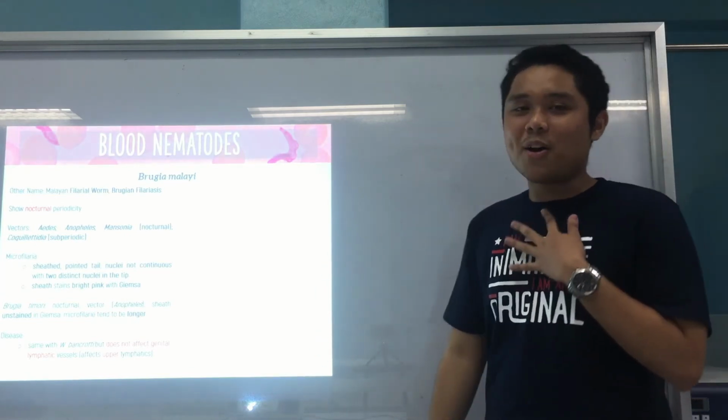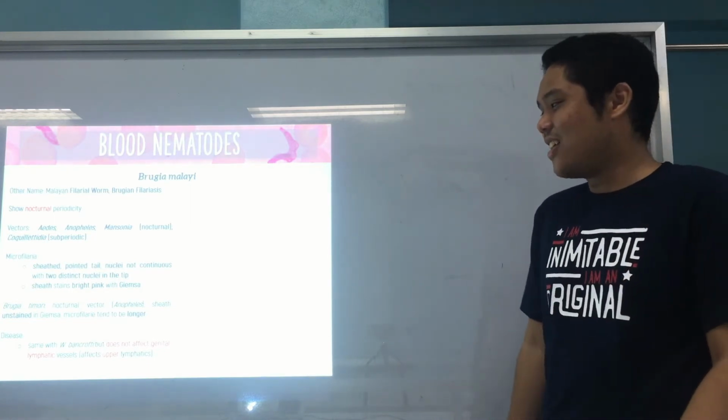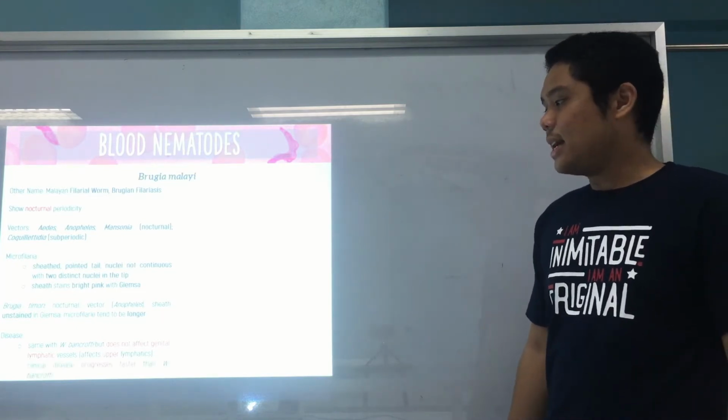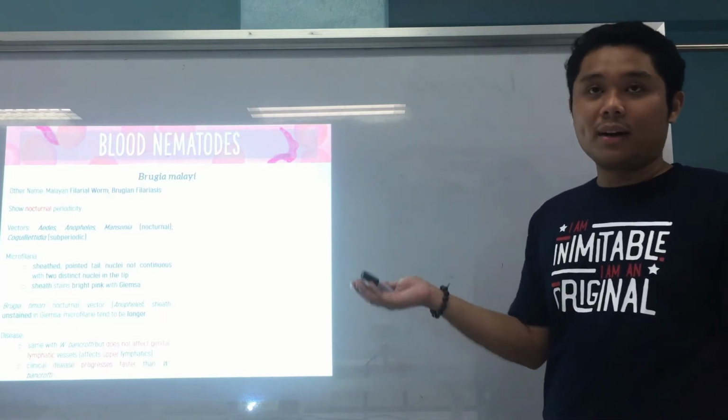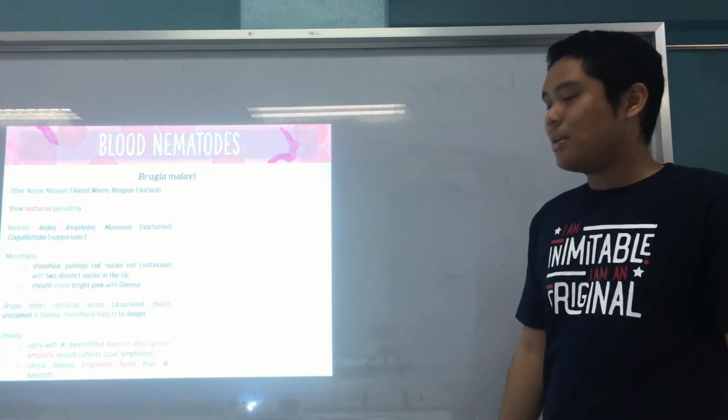Alright, I hope it helps, or that the mnemonics are effective. So that's for Brugia malayi. The clinical disease is faster. It progresses faster than Wuchereria bancrofti.